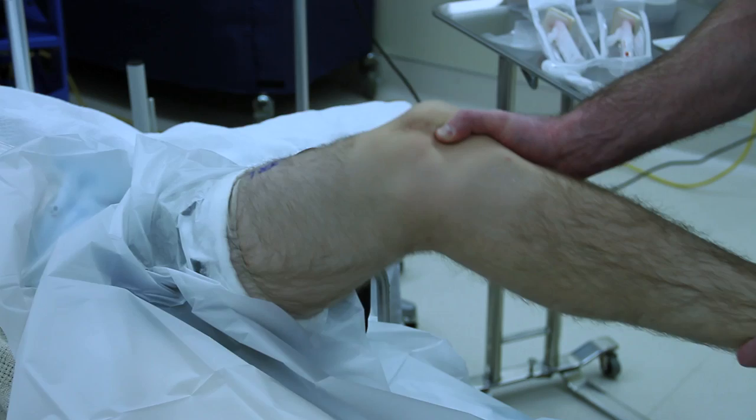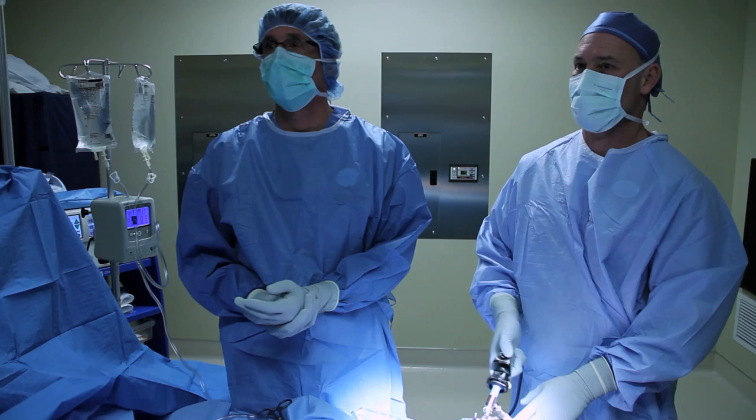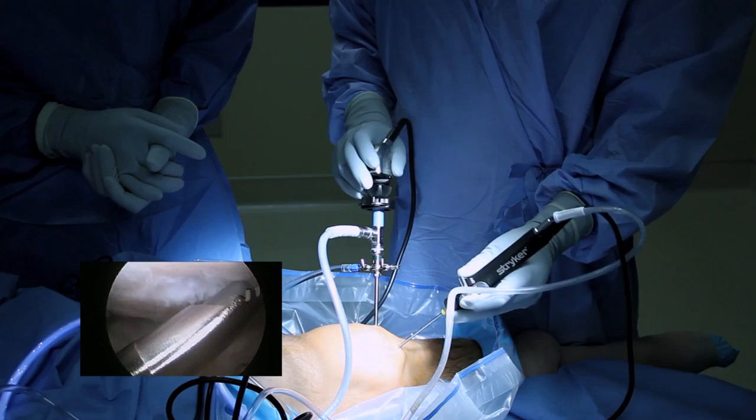The first step in the medial patella femoral ligament repair procedure is to confirm that the kneecap is unstable under anesthesia. In this case, the kneecap is dislocating. The next step is to perform a diagnostic arthroscopy to make sure there are no loose bodies or intra-articular injuries that can be seen and fixed at the time of surgery.